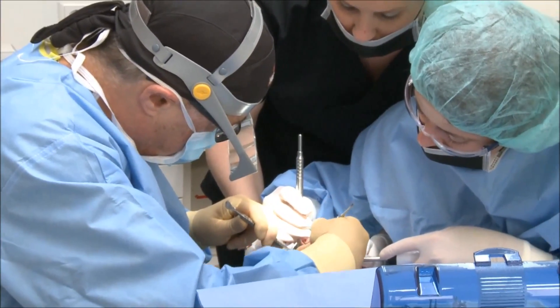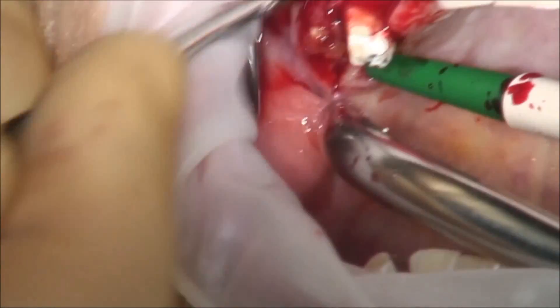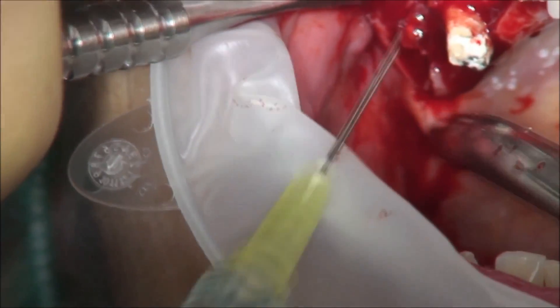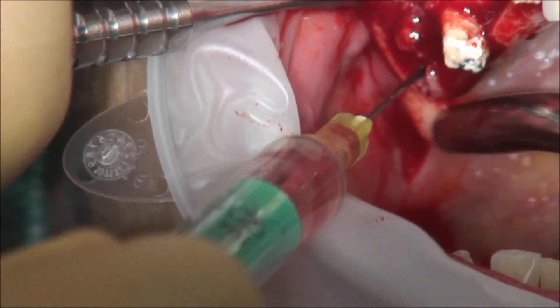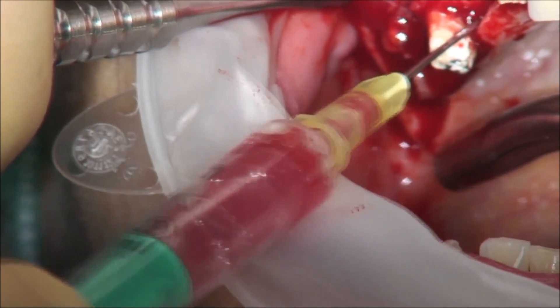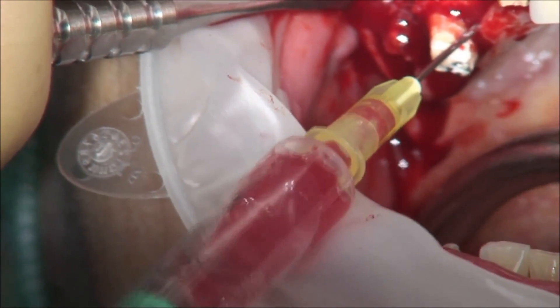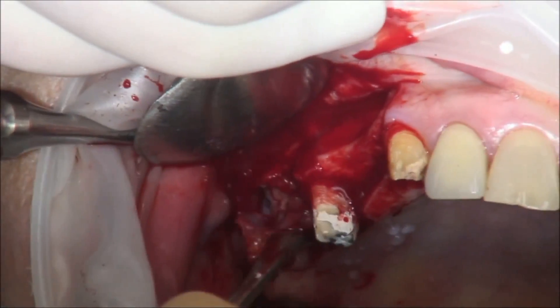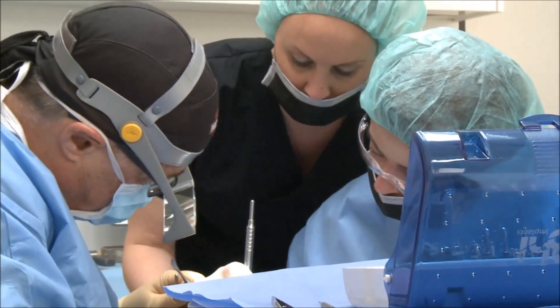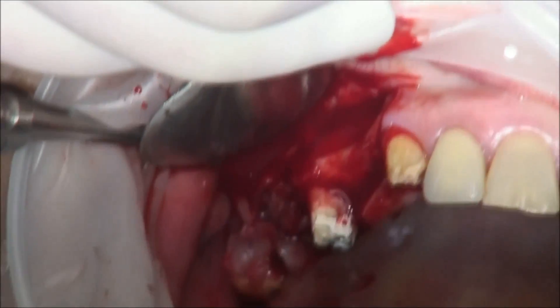As you can see here, the destroyed first molar and the mobile second premolar. As a first step after opening the flap, we collect blood to activate the beta-TCP we are going to use. Now, opening the flap.